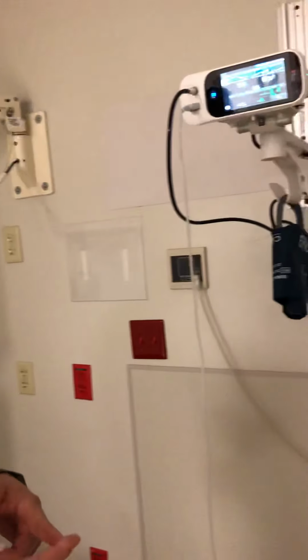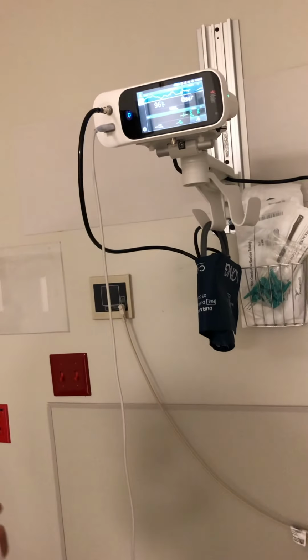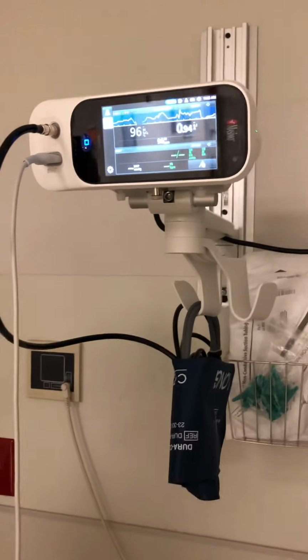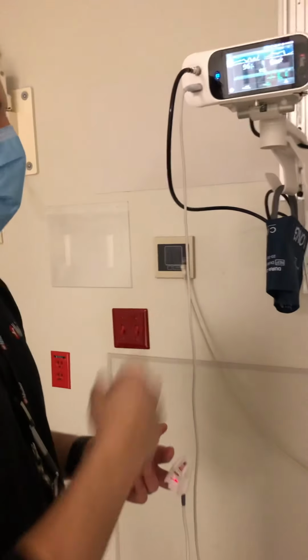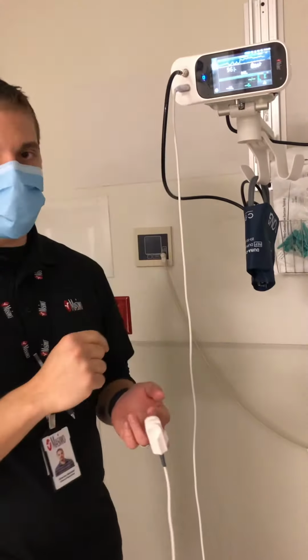They could have a titch of Raynaud's, they could have a lower ejection fraction, poor cardiac output, so on and so forth. Okay, so you can see I'm actually below 1 right now, but I'm kind of animated and I'm talking to you guys, right? So what you can do on a challenging patient if you're experiencing SpO2 dropouts, okay?